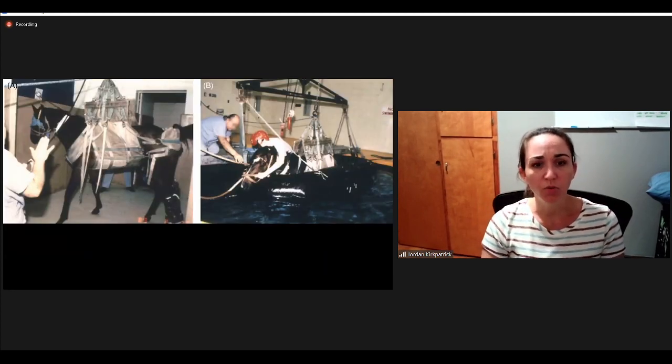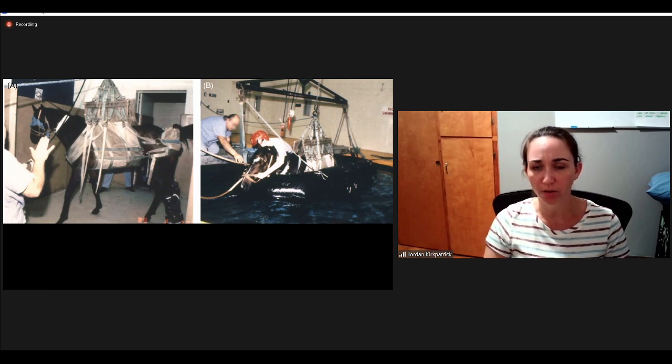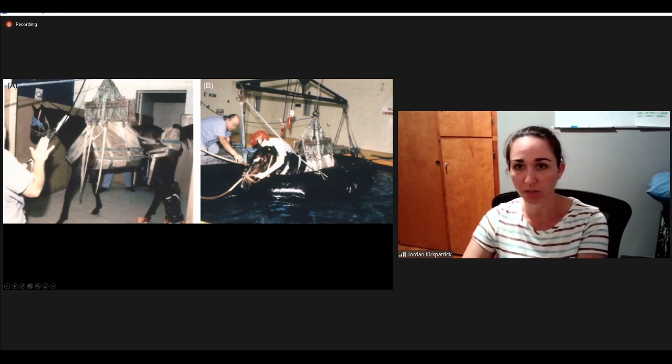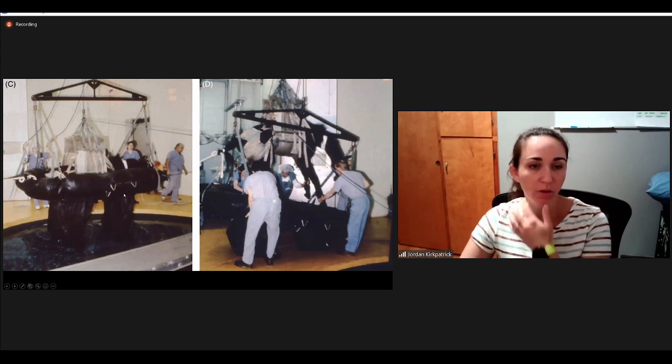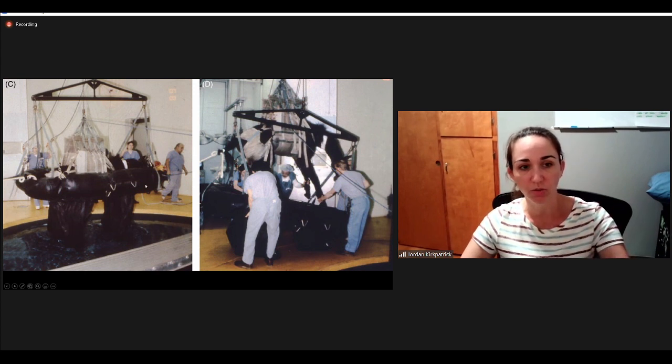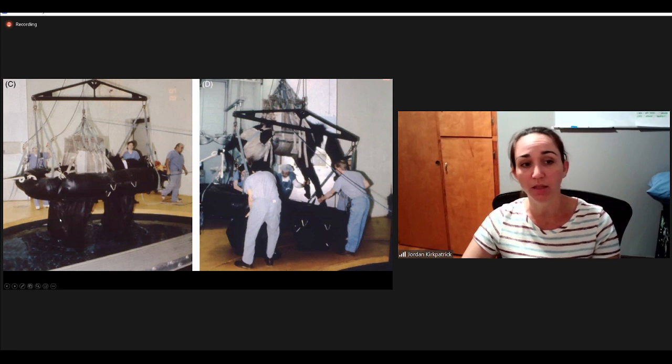This is another pool recovery system that they have at the University of Pennsylvania. So the horse is in the sling and it's placed in this pool raft, and there's the sling still on it. And then they'll pull them out of the raft, and you can see here their legs are just placed into extensions on the raft that prevent them from getting wet.